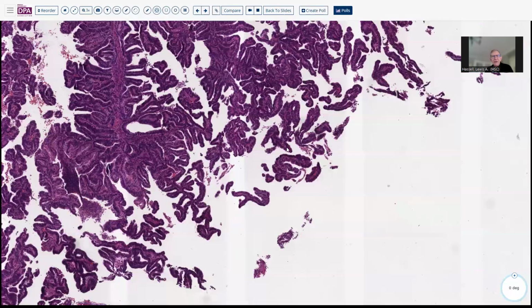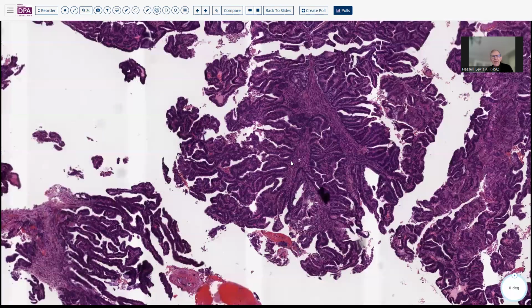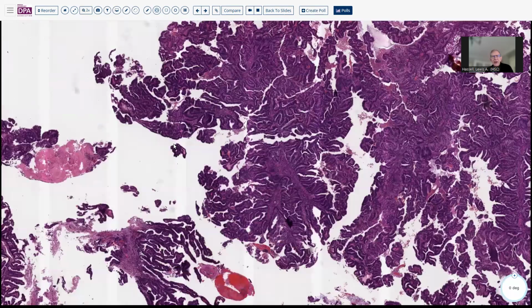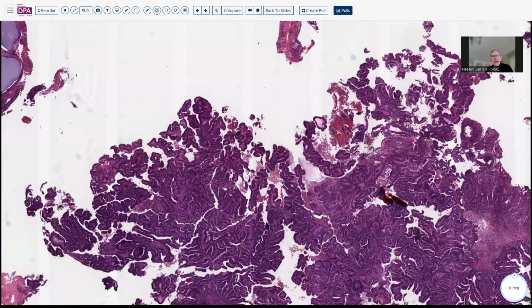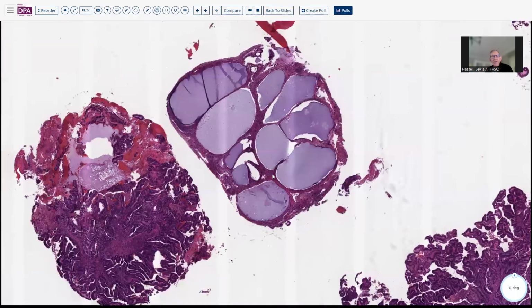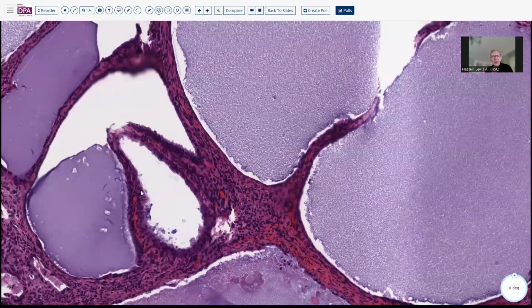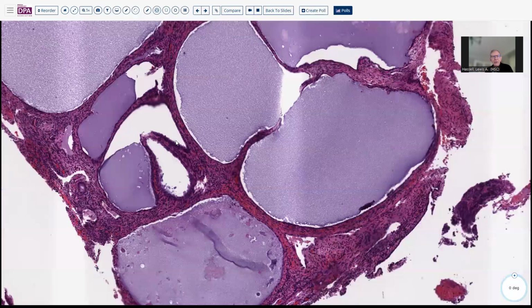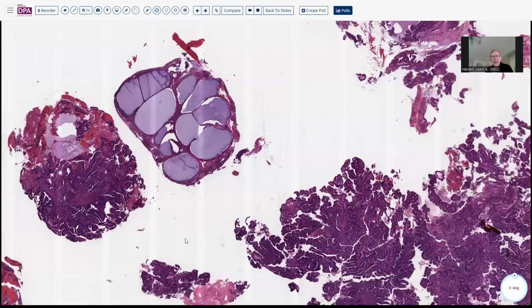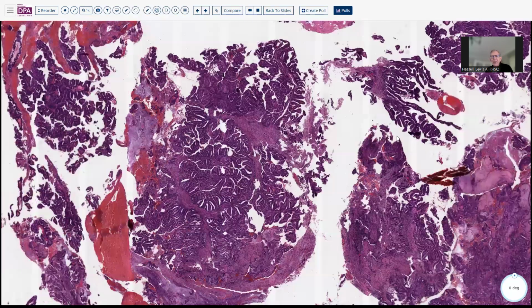Now, the distinction between this and endometrial intraepithelial neoplasia: I've mentioned necrosis. I don't see that here, but just the extent and confluence of the growth here should probably be enough to persuade you that it's going to be carcinoma. You may still have some areas of normal or atrophic endometrium remaining. Here you can see for comparison how small these glands are. And that tells you, of course, that the patient is postmenopausal and that this process has arisen in that setting.